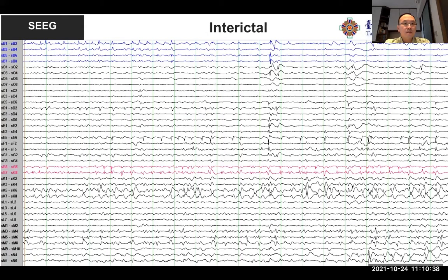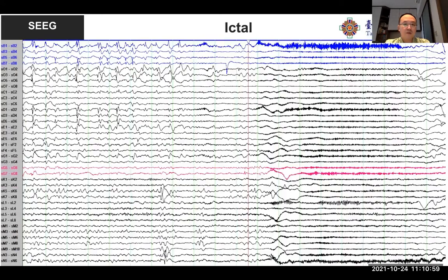We labeled electrode B as blue and G as red to identify which polymicrogyria is more responsible for seizure onset. You can see the interictal spikes, and it's actually a very large irritative zone. When looking at ictal onset, the B electrode is earlier, and the OD electrode is also quite early, then G has accumulation.